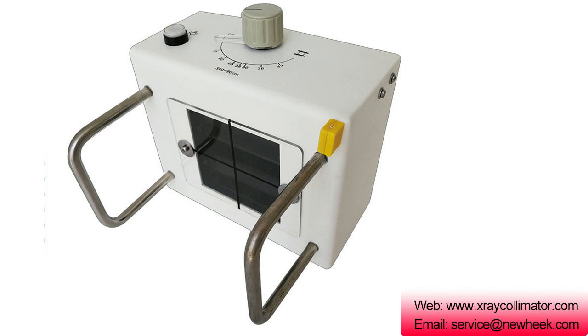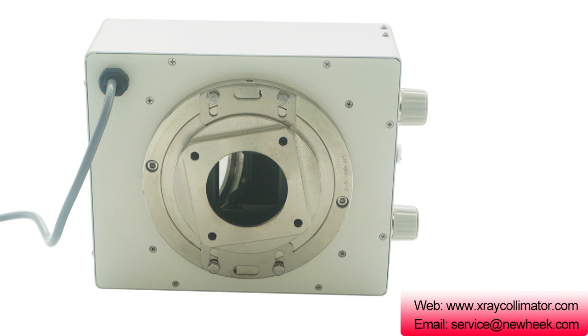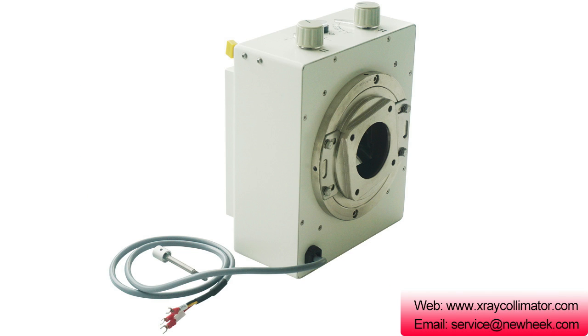NK-103 Collimator. Application: it is specially designed for portable X-ray units and is mainly used on 125 kV X-ray sources. Main Specification: suitable X-ray tube max voltage 125 kV. Max irradiation field at SID/FFD 900 mm: no less than 430 mm x 430 mm. Mini irradiation field: 10 mm x 10 mm. Inherent filter: 1 mmAl at 75 kVp. Lead leaf control mode: manual.